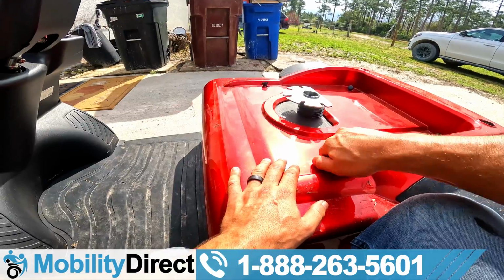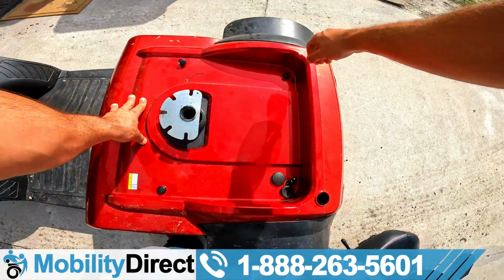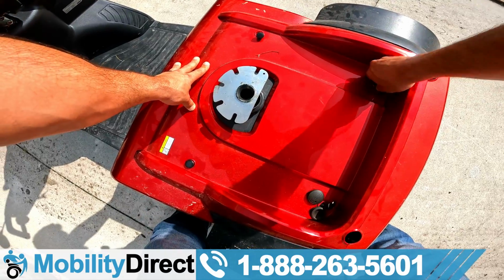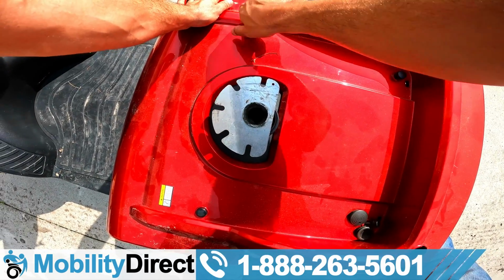We're almost done here. The only thing that's really left to do now is to actually test the unit out and make sure that the error 1 code's not happening anymore. And I'm pretty confident that we figured it out. So I'm just gonna go ahead and put my hand screws on here, and we'll be right back with you.